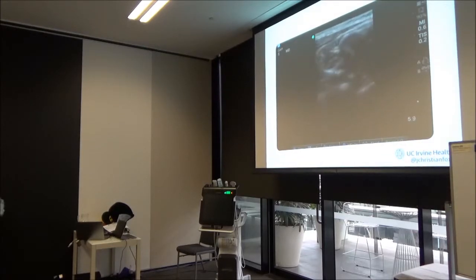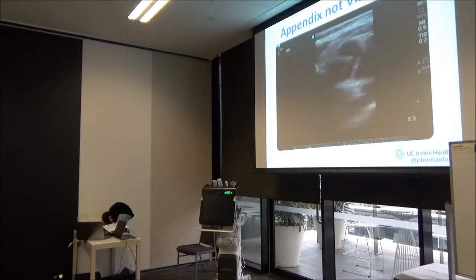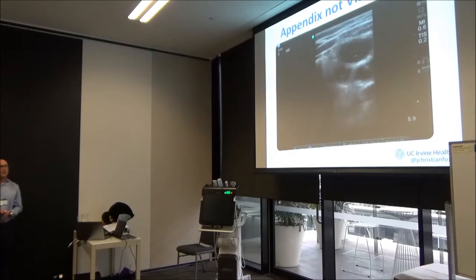This is kind of what happens. I just compress. Here's psoas here. I'm compressing it. I just don't see the appendix. I spend 3 or 4 minutes looking for the appendix. I don't see it. I give up. I go to another patient. If I had a medical student around me, though, I'd say, hey, go in there and hang out for half an hour, see if you can find it. It depends how uncomfortable the patient is.